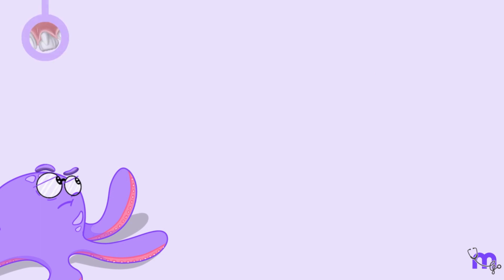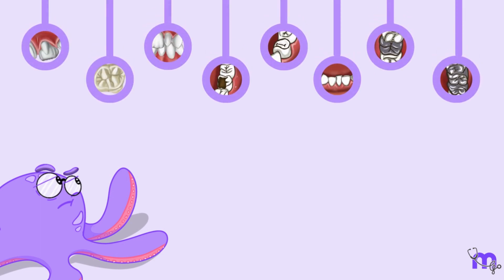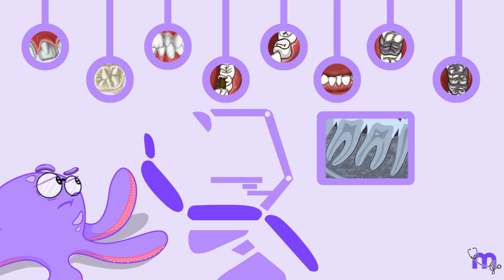Well, as it may be understood, not all these components are visible to the naked eye. So, to detect them, the invisible force of endodontics, that is, radiographs, gives us an almost accurate knowledge of the root canals and their variations.